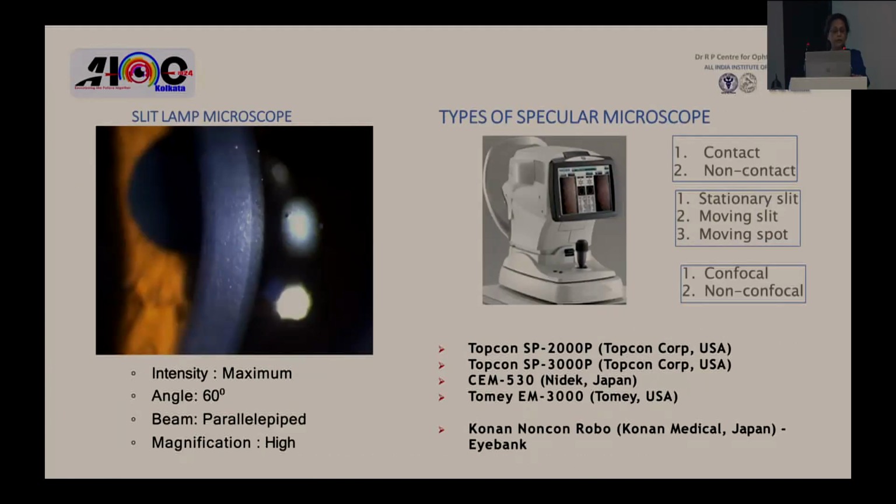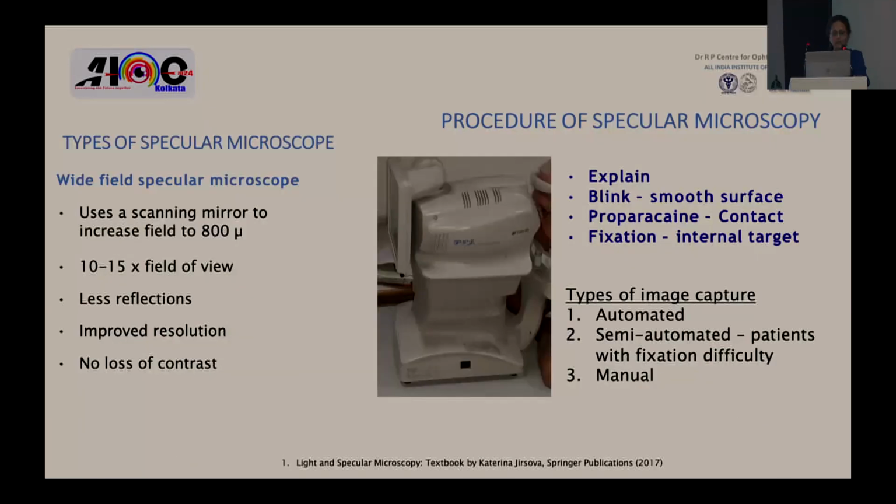Again, a word of caution: what you look at at a routine slit lamp examination is not specular reflection. It is very difficult to do a specular reflection. You will have to know how you need to seat yourself here, how you would have to place your illuminating piece and your main piece, and you'll have to move it across 30 degrees in an oblique angulation. So that again is another learning methodology, and you'll probably need a hands-on before you would understand the specular reflection method. And I will have to acknowledge it's usually a very difficult methodology of looking at your endothelial cells by specular reflection methods here.